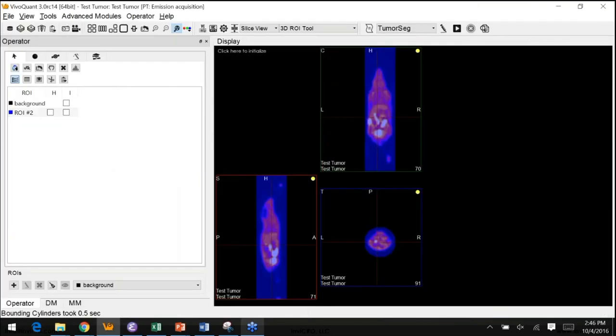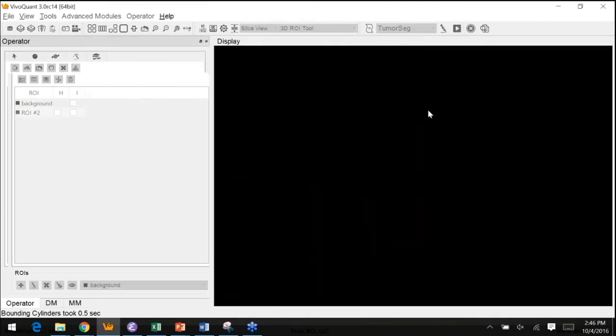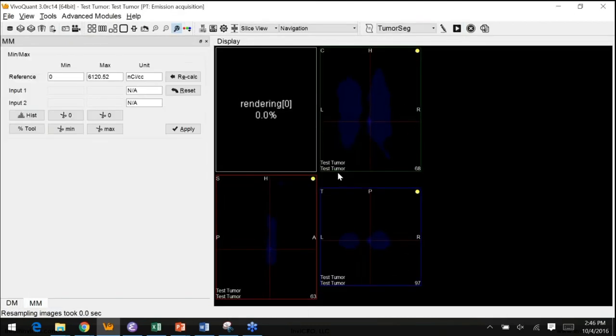So let's see how I've done here. Oh, I'm going to run it up here. That's the way I should do it. Great, loaded.